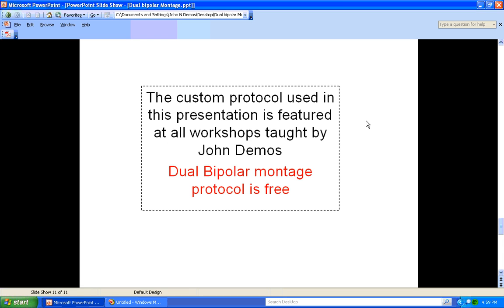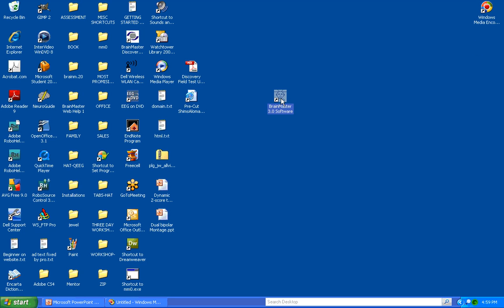The custom protocol used in this presentation is featured at all workshops taught by John Deimos. The dual bipolar montage protocol for post-traumatic stress disorder is free. Now let's review setting up and using this protocol with BrainMaster software.